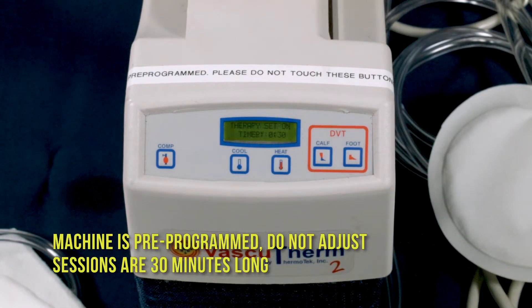The machine is pre-programmed. Do not adjust sessions that are 30 minutes long.